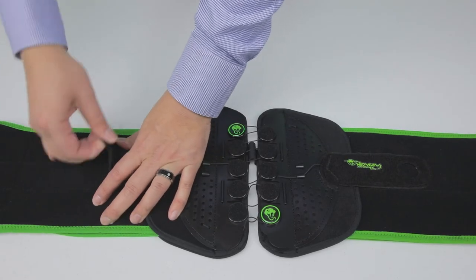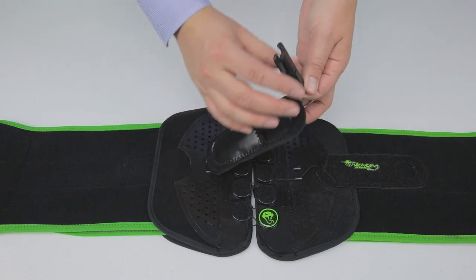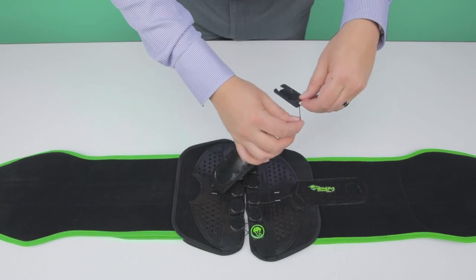To adjust the drawstring length for large or small patients, remove the reel from the pull handle pocket and decrease or increase length by reeling the cable in or out respectively.